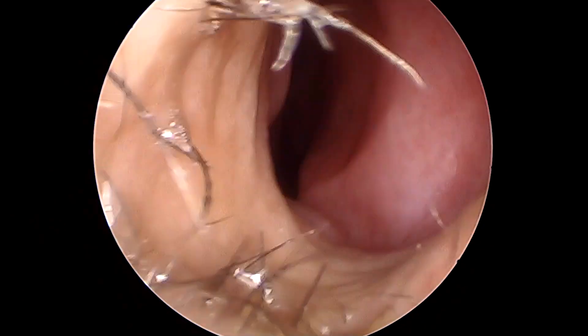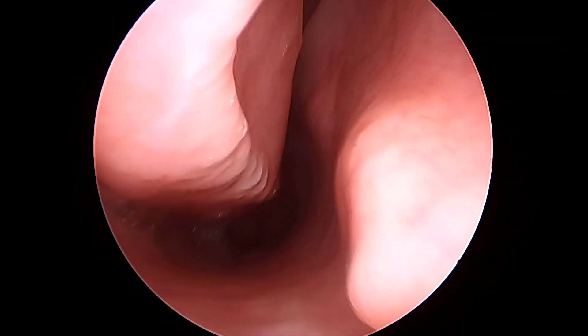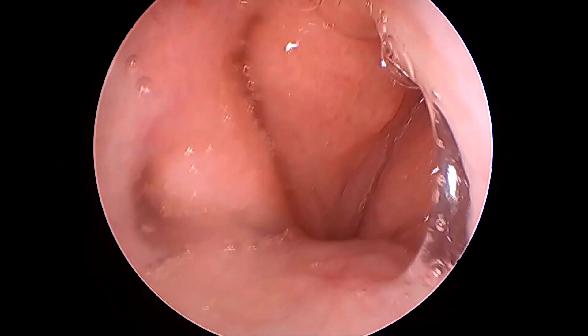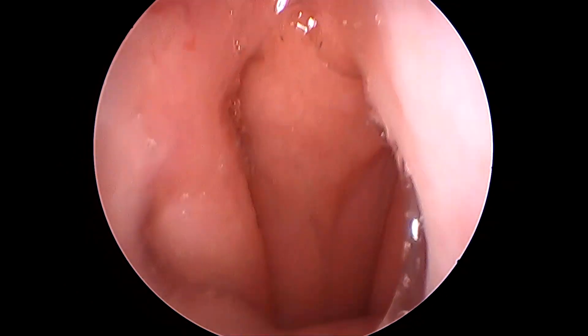This video will show you how to do a nasal endoscopy in a patient suspected for CSF leak from the nose. This is a female patient and I'm using a zero degree endoscope, going along the nasal floor — that's the choana. I'm examining this area to detect any fluid leak collecting in the nasopharynx.